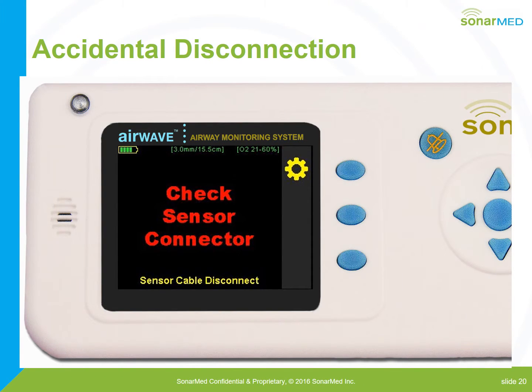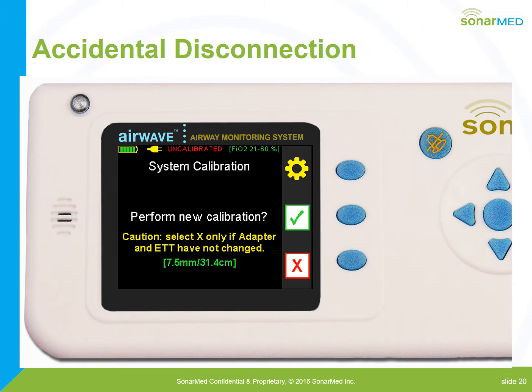So what happens if my sensor cable becomes disconnected from the monitor? I'm going to get a message that says check my sensor connection. When I plug it back in, it's going to ask me if I need to perform a new calibration. Do I have a new patient? My answer is no, I don't have a new patient. This is the same patient. So I'm just going to check that X, the blue oval at the bottom, and say no, I don't want to calibrate again.